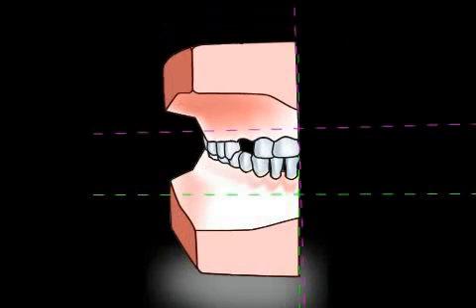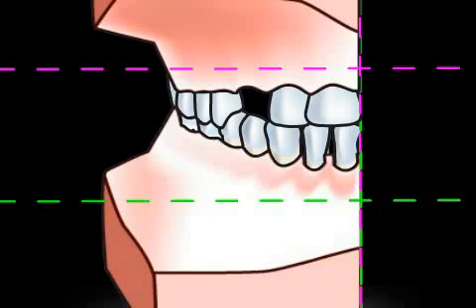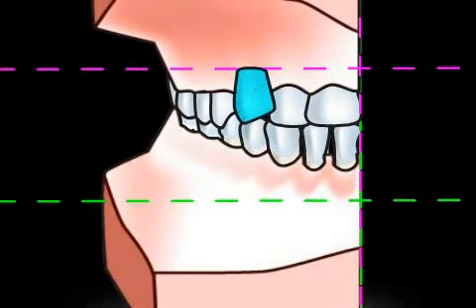When partial trays are used, the technician receives partial models. These are pivoted relative to one another, and thus can't be positioned clearly. The dental prosthesis, shown in blue here, cannot be molded accurately.